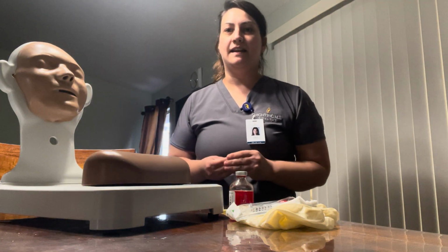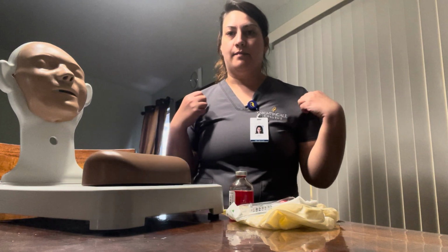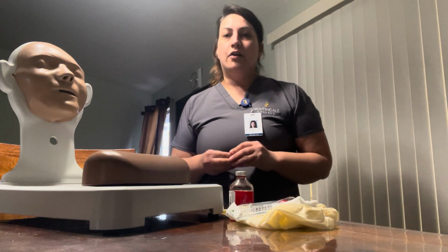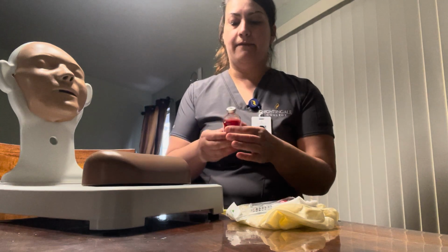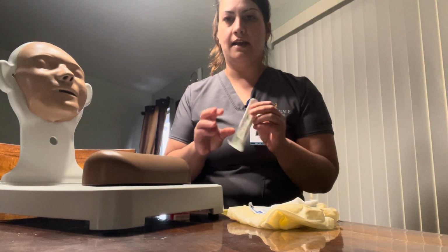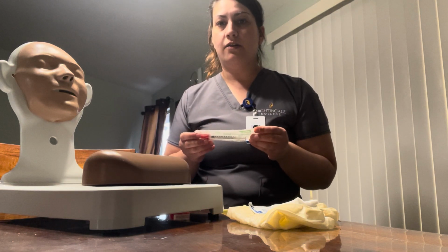Today I'm going to be presenting the subcutaneous injection. I'm in my appropriate school uniform. I will start by going over some of the supplies that I'm going to be using. I'm going to have my medication vial. I'm going to have my syringe, which in this case should have a 25 to 27 gauge needle.